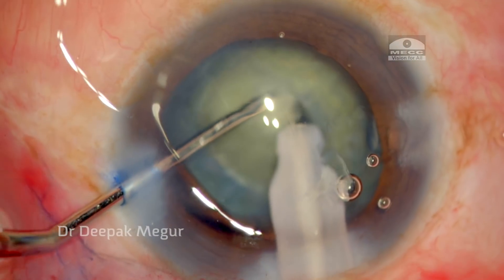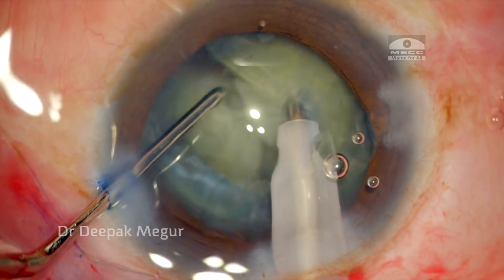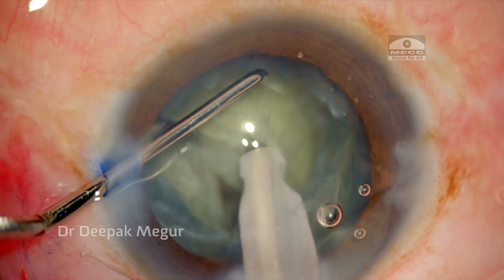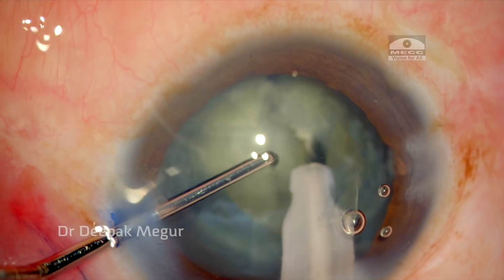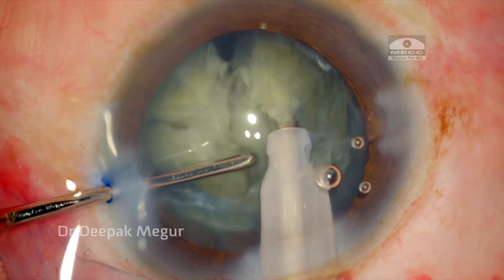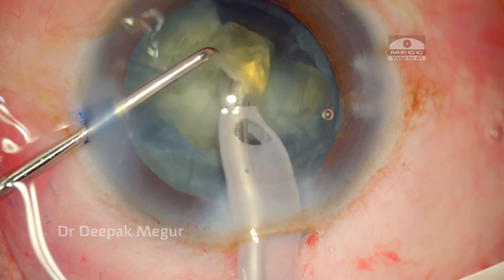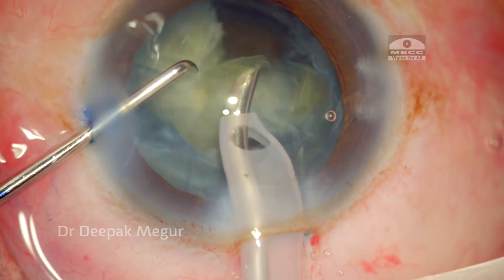I bury my phaco probe into the nucleus and perform a vertical chop using a sharp chopper. The nucleus is adequately scored so we can chop without any issue. Care is taken that during fragment separation we don't induce any stress on the zonules — I'm avoiding any rotation of the nucleus. Once separation has happened, the probe engages the adjacent nuclear fragment and the chopping and lateral separation is continued. I lift the nucleus out of the bag, divide it, and aspirate one fragment in the pupillary plane.